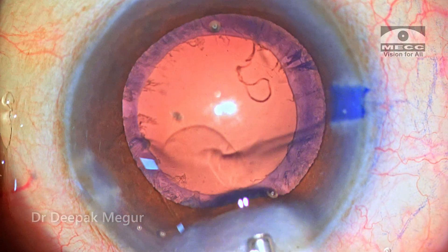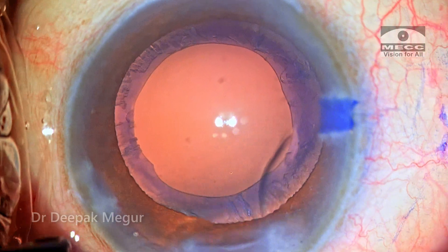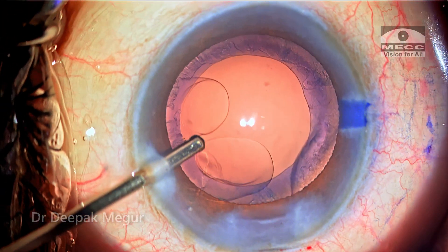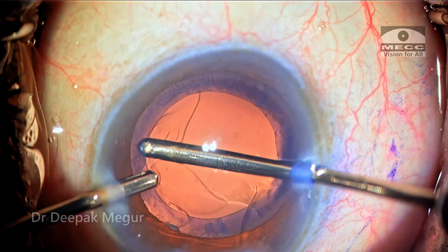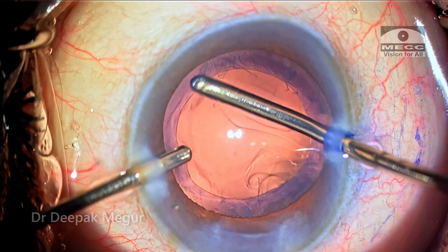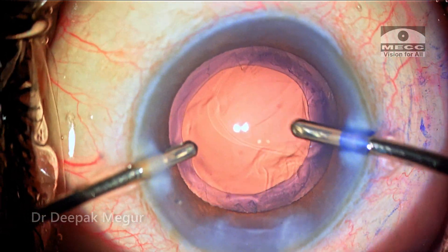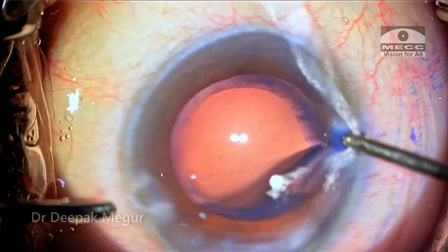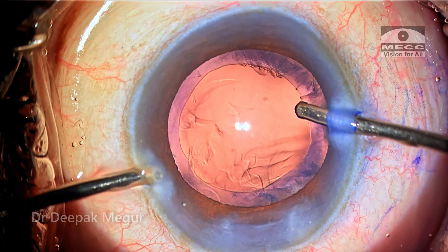Time to remove the cortex. Before that I usually prefer to inflate the bag with OVD, and then the bimanual I/A can get in and the cortex is aspirated. I'm using the tangential method of stripping the cortex to ensure I don't catch the anterior capsule or the equator of the bag. Especially in these hypermature cataracts, the bag and zonules are very fragile and weak, so I prefer the tangential method of cortex stripping.